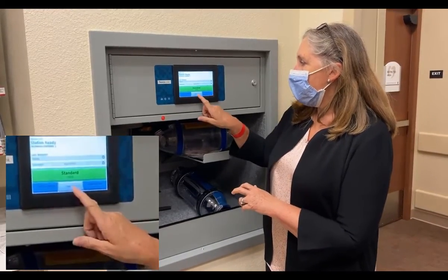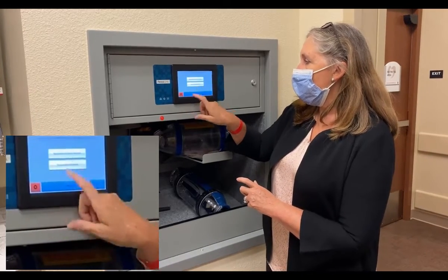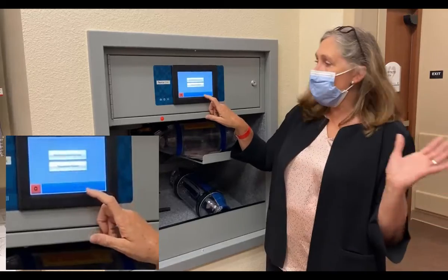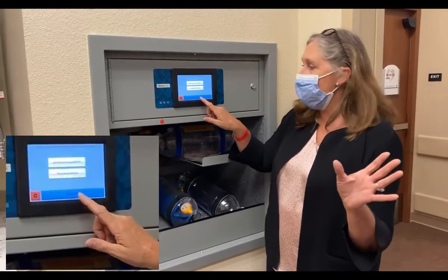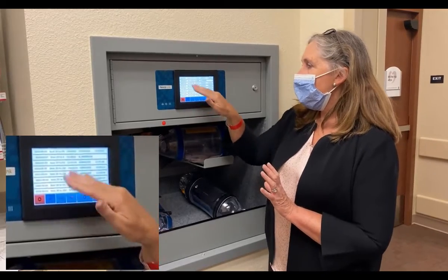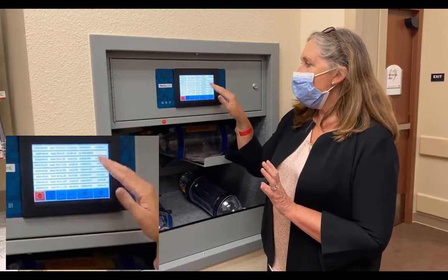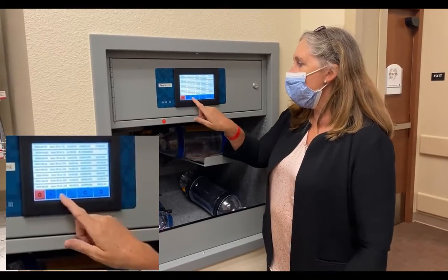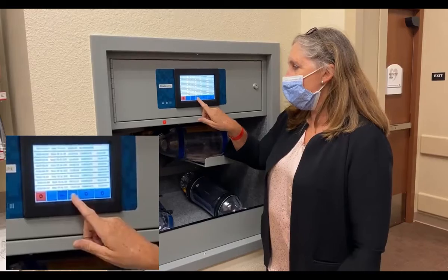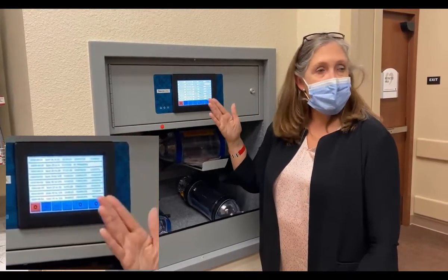The options button in the middle, maintenance staff will use this as a maintenance button. Clinical staff doesn't need to know that. You can look at a brief transaction history. This tells you the last 25 things that you sent or received, or both. And it just displays your recent history.